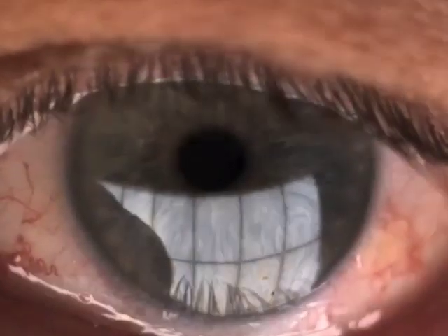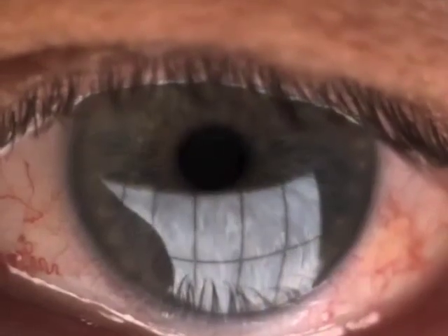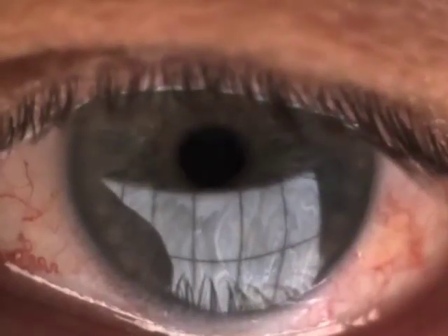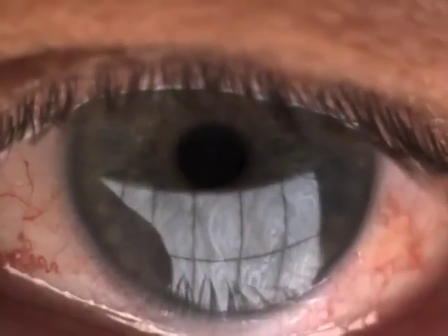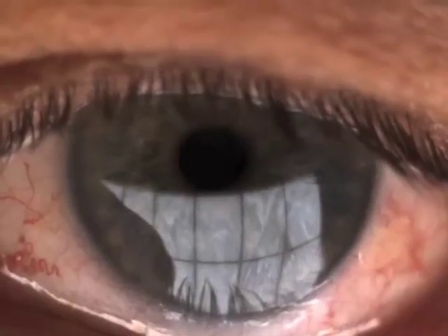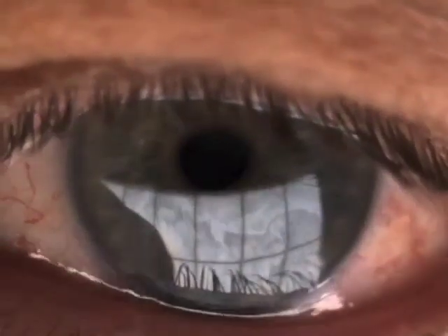The oil is very important as it prevents the evaporation of the tears. Many patients suffer from dry eye symptoms because of a lack of oil in the tear film.